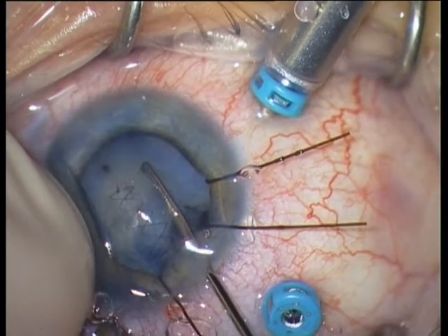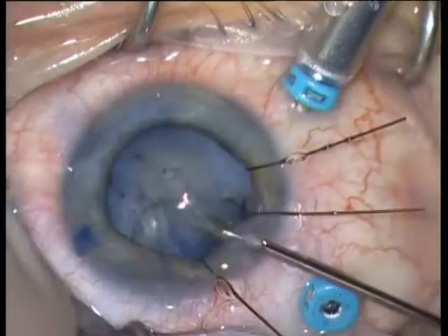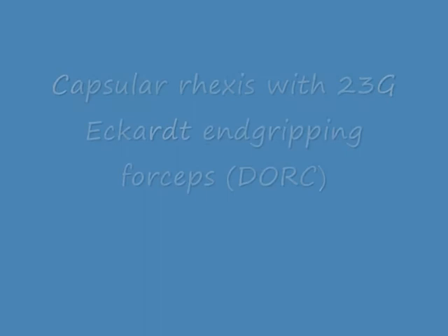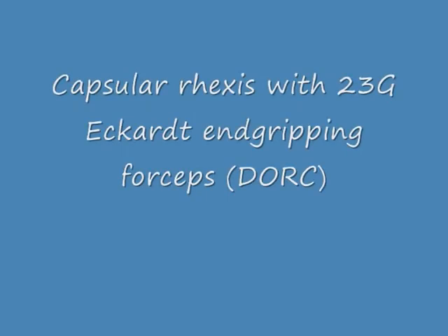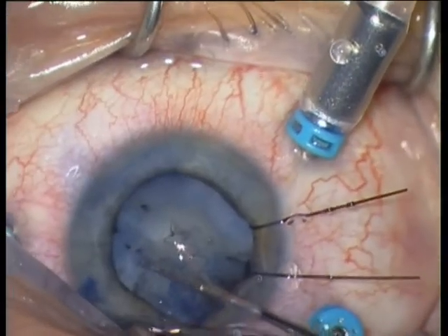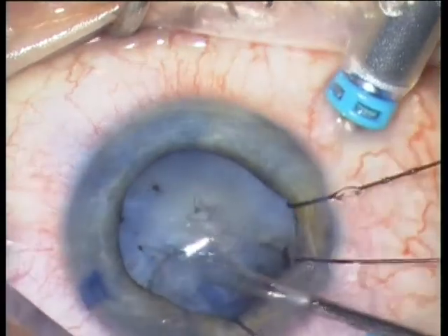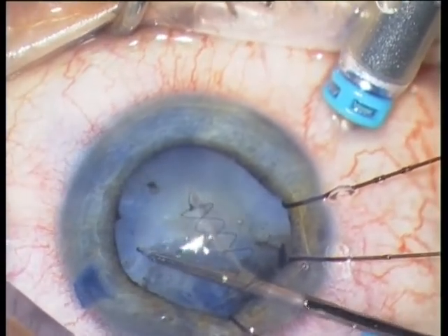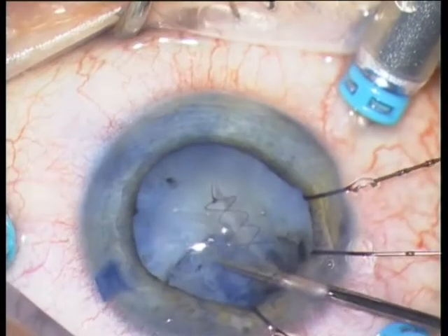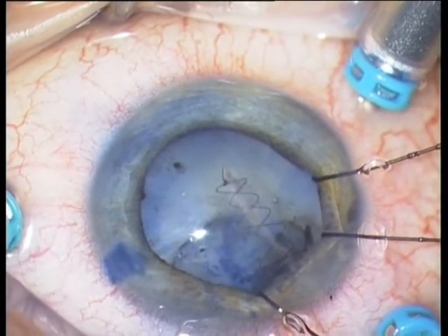You can work here through the sclerotomies. You see that a rhexis is very possible in this very difficult and traumatic eye. You need the anterior rhexis for sulcus positioning of the IOL, so do your best to preserve the anterior capsule.